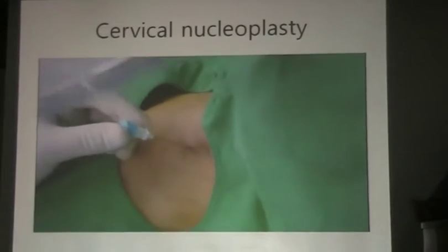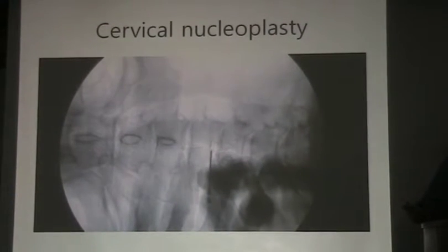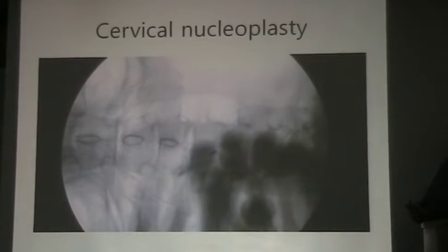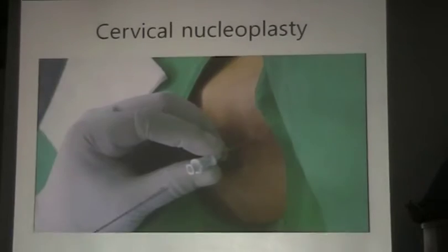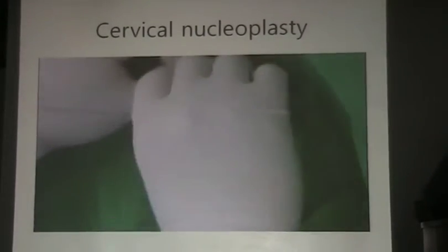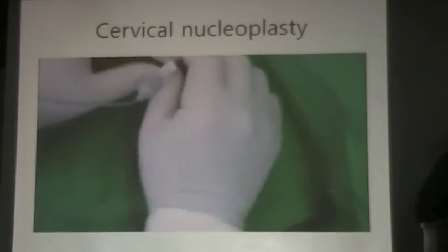You can see. Yes. Nucleoplasty needle insertion in the middle of the C5-6 disc space and insert the nucleoplasty catheter like this.